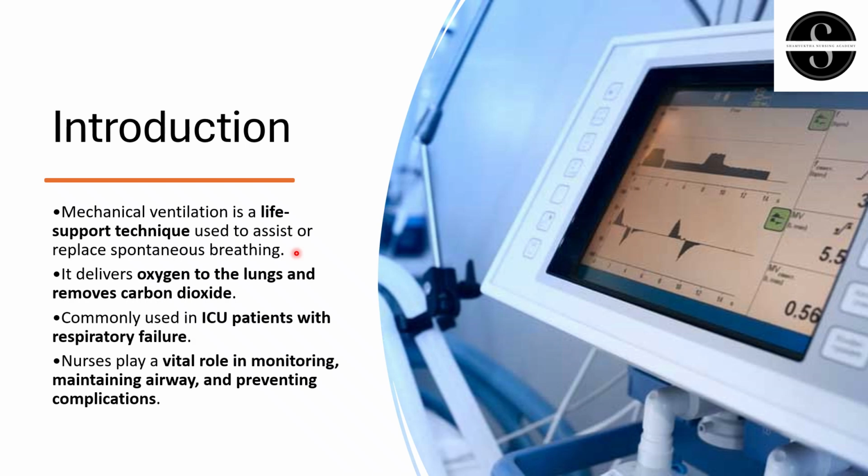What does it do? It delivers oxygen to the lungs and removes carbon dioxide. Clear? Like what our lungs do, the same concept the mechanical ventilation will do. This is the main function of the mechanical ventilator. So in which patients do we use mechanical ventilation?